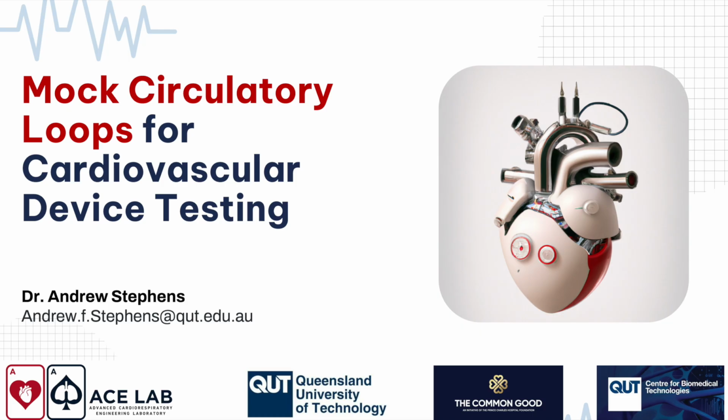So the science, what is the Windkessel model? It's basically a mathematical model that models blood flow through the vessels, and it comes in 2, 3, 4, and 5 element variations. I'm showing you here the 5 element variation. So the first element is arterial resistance, which is the resistance to blood flow caused by the arteries. Inertance, which determines how the inertia of the fluid moves through the system, arterial compliance, venous resistance, and venous compliance.